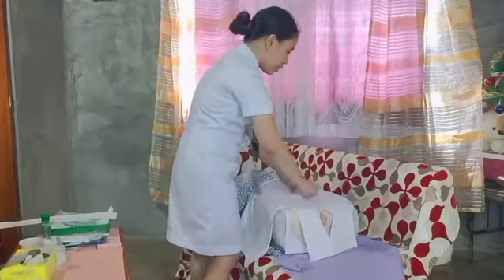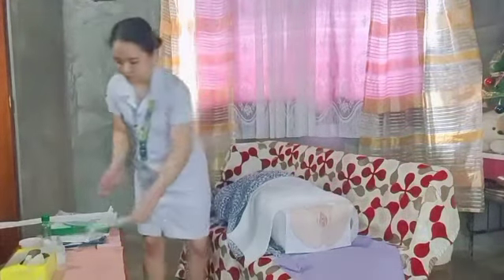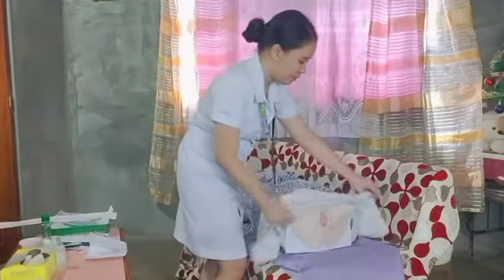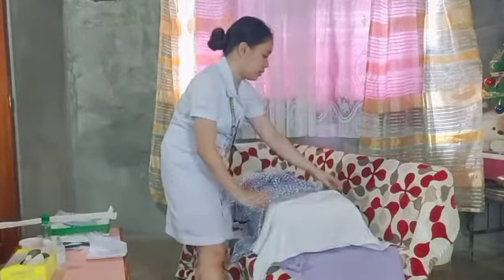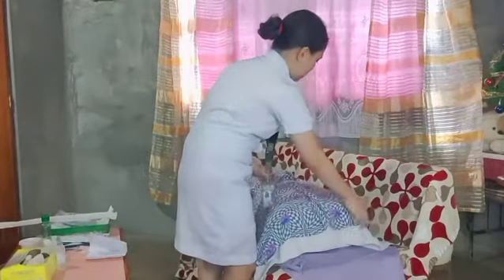Yan, expose na po natin ang inyong private area. So that's how we remove the female catheter from the patient.